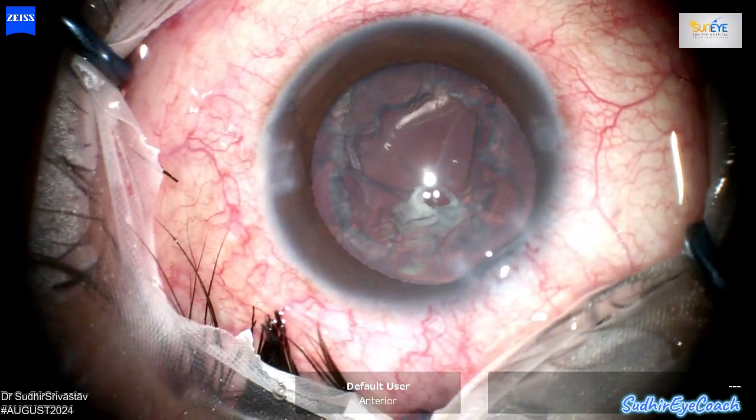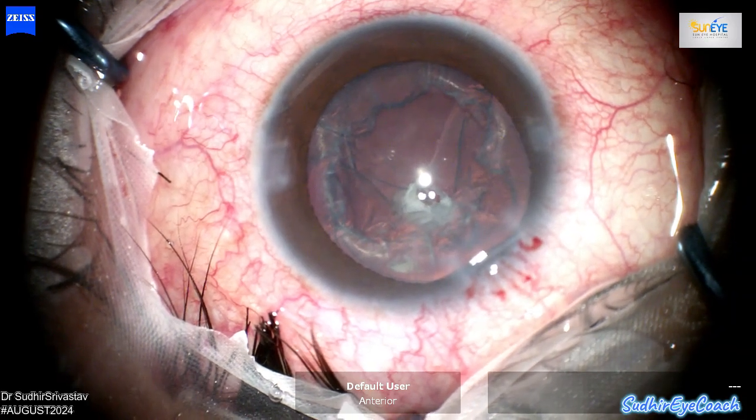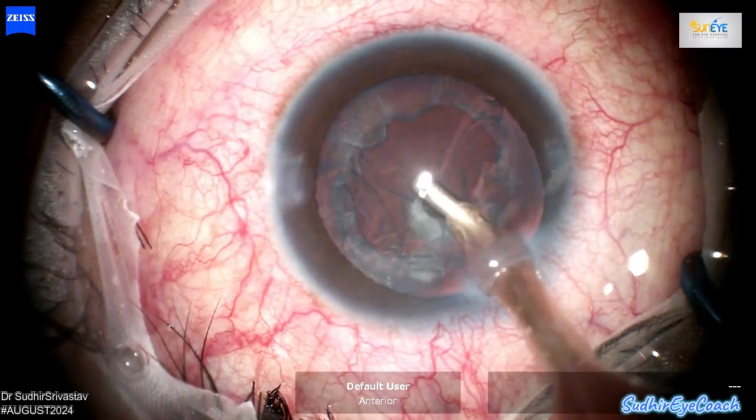At this point, I noticed a small posterior capsular defect, which aligns with what was evident during the preoperative examination. This confirms the importance of careful planning and awareness in such cases.